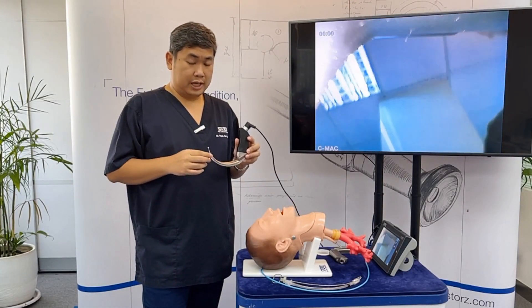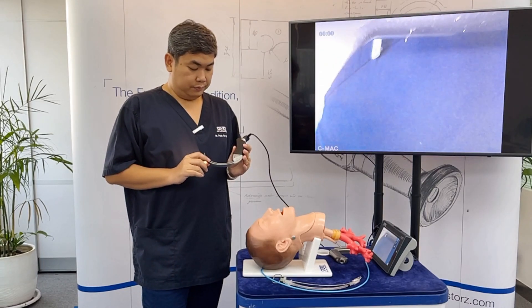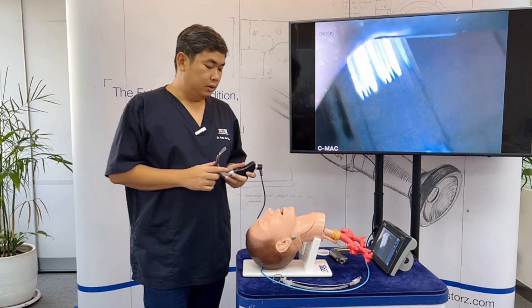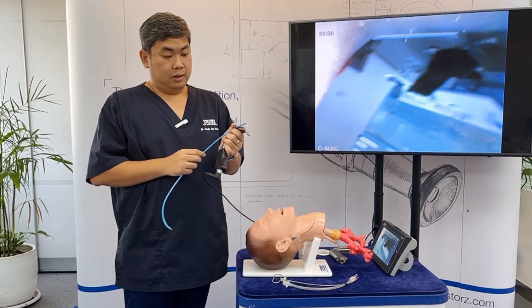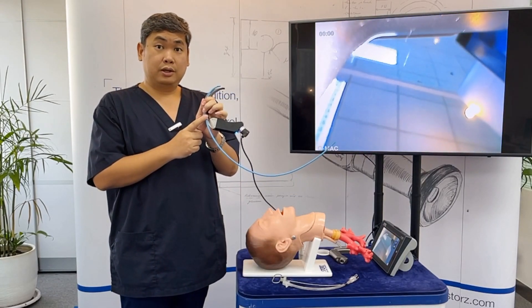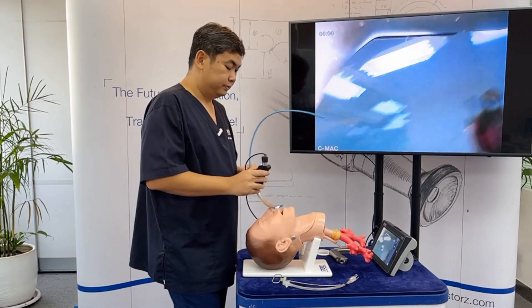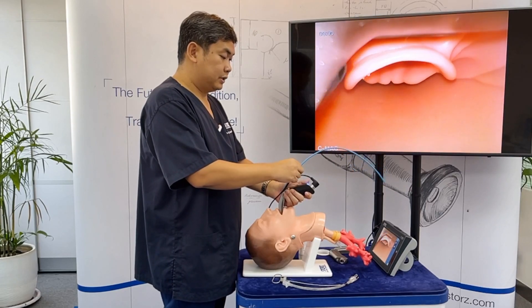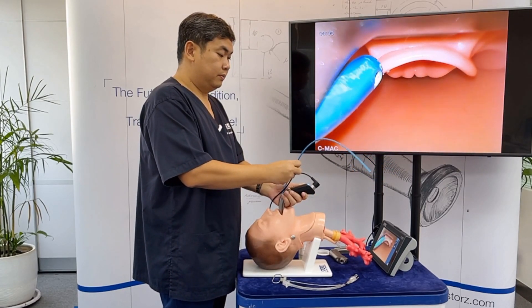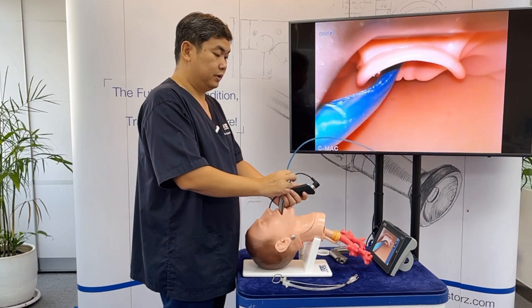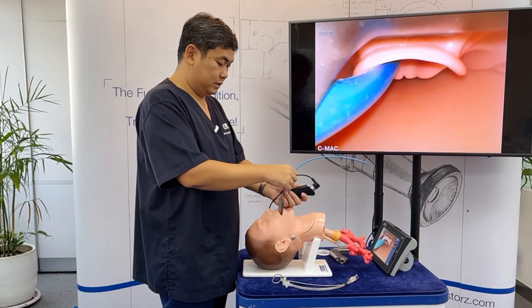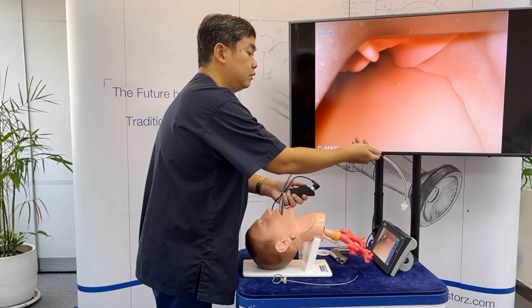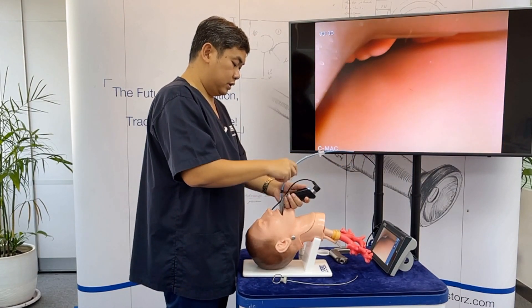Another technique is to use the suction port on the video laryngoscope. For the C-MAC, the D-Blade has a suction port, and for the Macintosh 3 and 4 it is optional. You can place the bougie through the suction port and direct it by twisting and pushing it forward. Once it has entered the glottis, you can railroad the ET tube over the bougie.